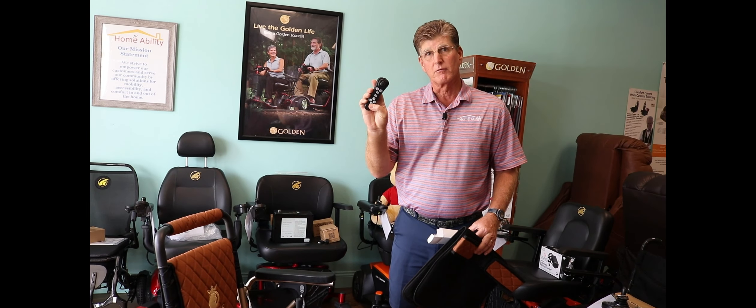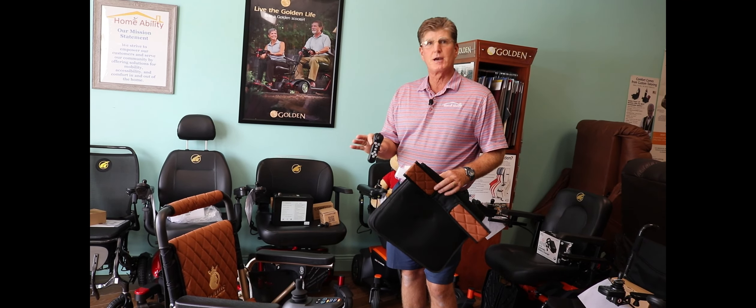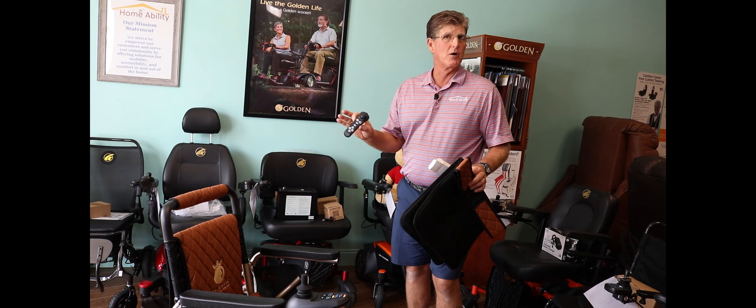You can also fold the chair from the remote. These features alone make this chair stand alone in the marketplace.